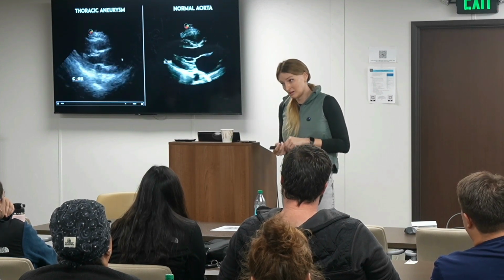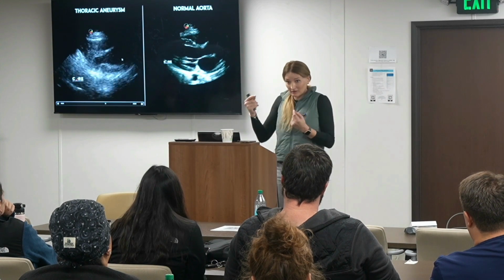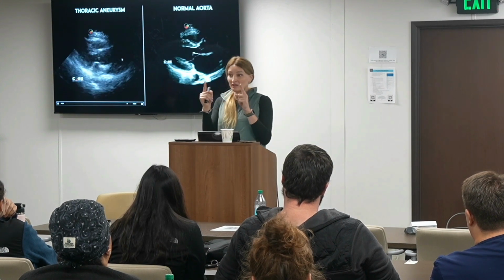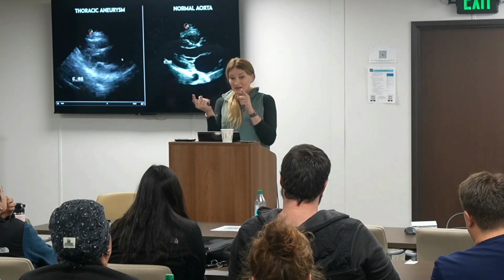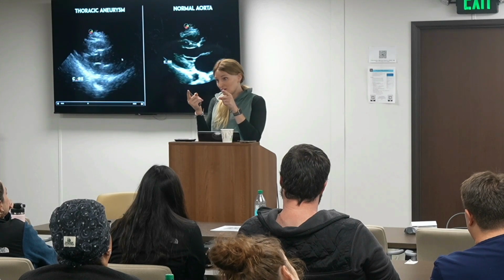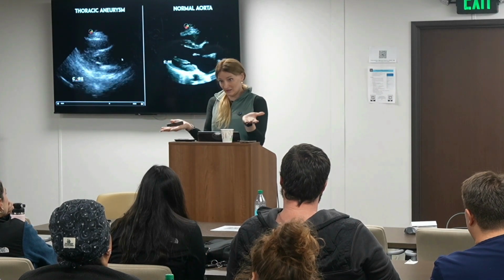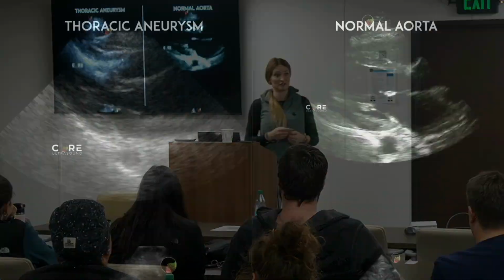That's when I measure. And I say that because it's about being efficient, right? Another little trick: the average width of the vertebral body in the lumbar area is about 4 to 5 centimeters. So I don't measure aortas unless they're over half of the width of the vertebral bodies, because I'm lazy and I don't like doing extra work. And this is one of those ways that you can be a little bit more efficient.